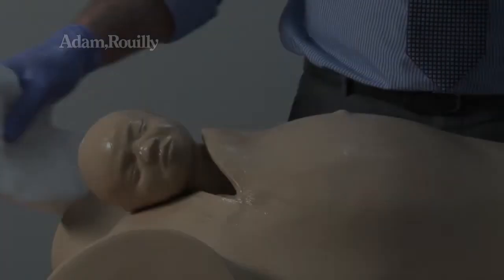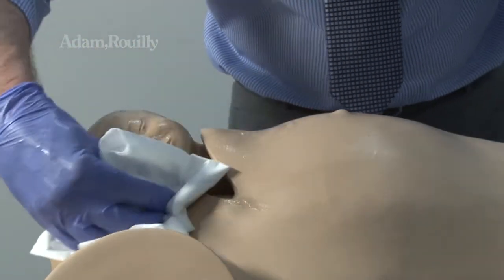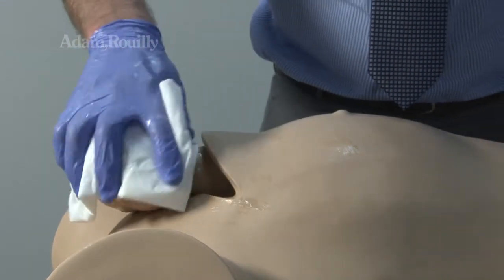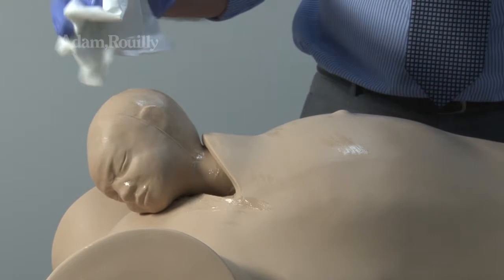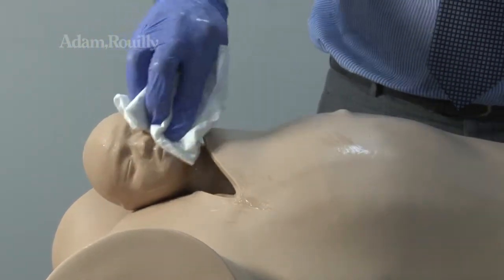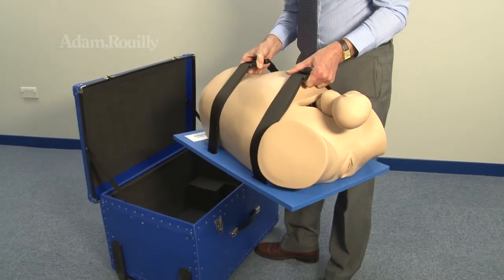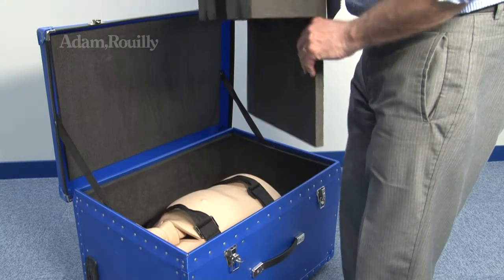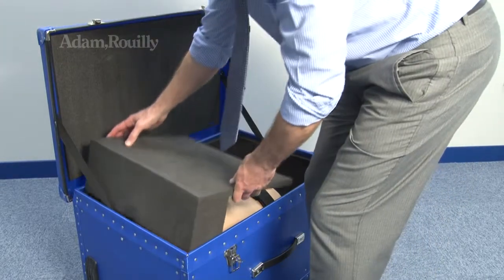After use, when training is complete, clean the model with a soft cloth. Before storage, the fetal head must remain extracted. Use the supplied carrying case to store the model.